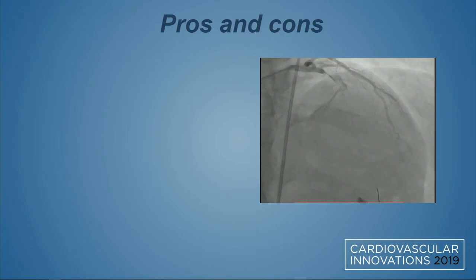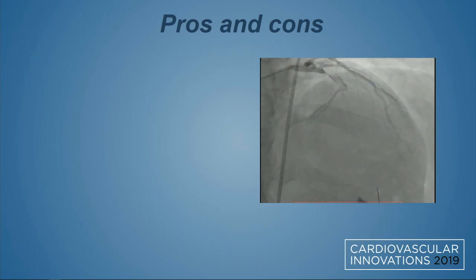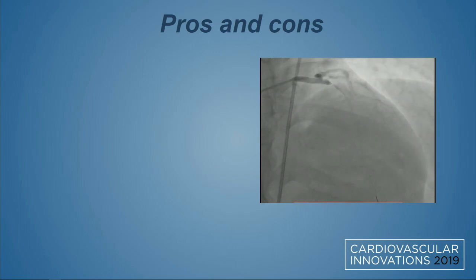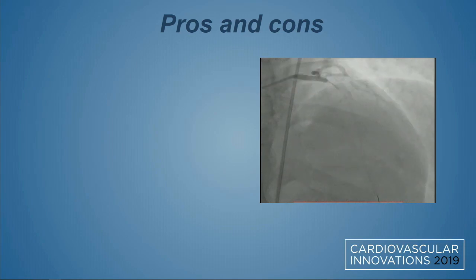Because you did have difficulty with the wire? Not difficult. The wire is bending here every time. So my course director said you are in the false lumen. What wire did you use? Sion wire. Okay. Well, this definitely was some troponin, but there were collaterals all the way from the right. So I'm not sure how acute, whether this had been there for a while or not. Yes, chest pains started 12 hours before coming to our institute. So I think it was non-STEMI, because of retrograde filling.